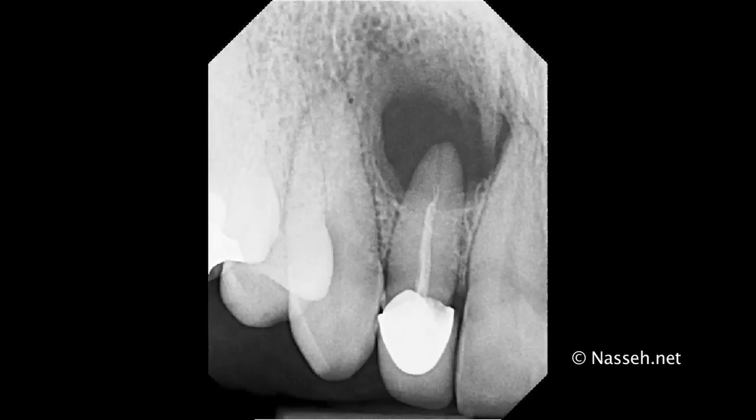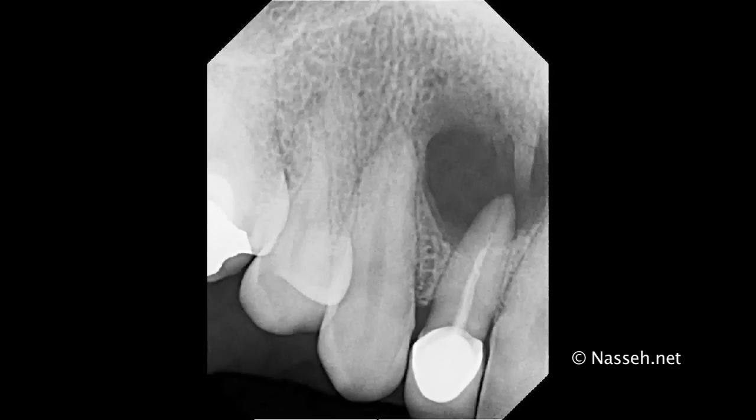In this case, my first option was to retreat this tooth conventionally through the crown, and a new crown was recommended to the patient. However, due to financial restraints, the patient was unable at the time to have this tooth treated with a complete retreatment and a new crown. Here shows another angle.